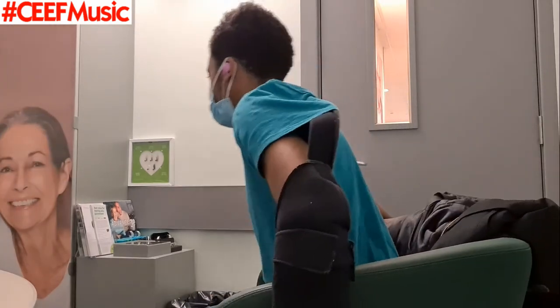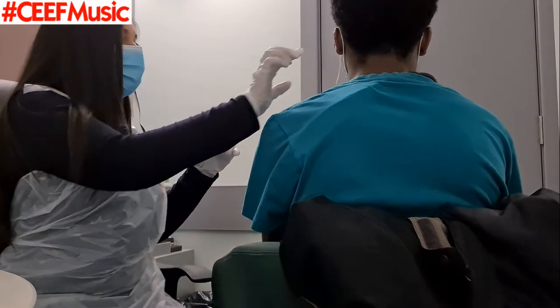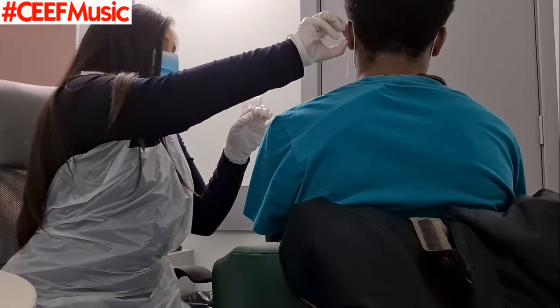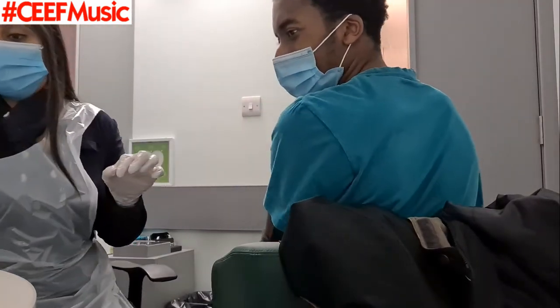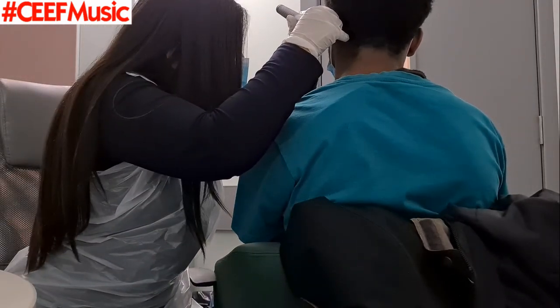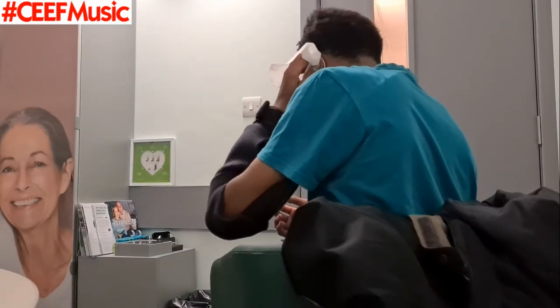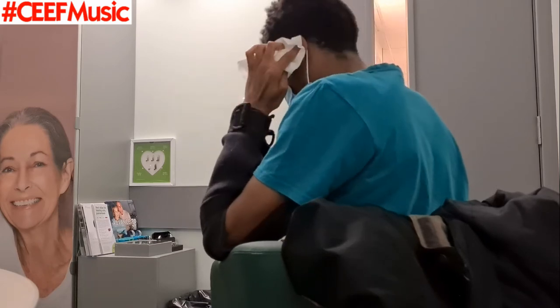Now it is time to remove the second impression — it's not like I have three ears. So the one in the left ear — she taps it, makes sure it's all good, moves it out gently or however it needs to be taken out. And boom, she's got to check my ear. Honestly, safety — it's brilliant. And yeah, wiping out my ears. Nothing came out because my ears were brand spanking clean after the wax removal.